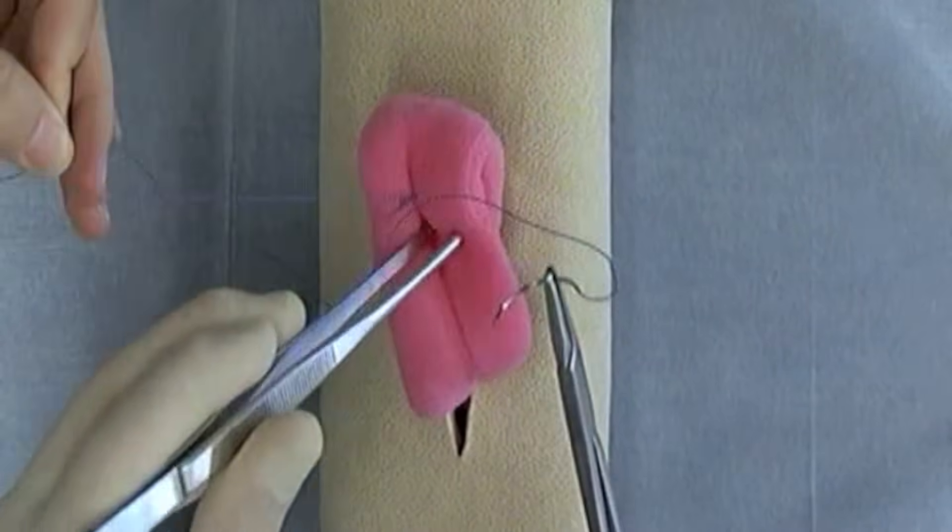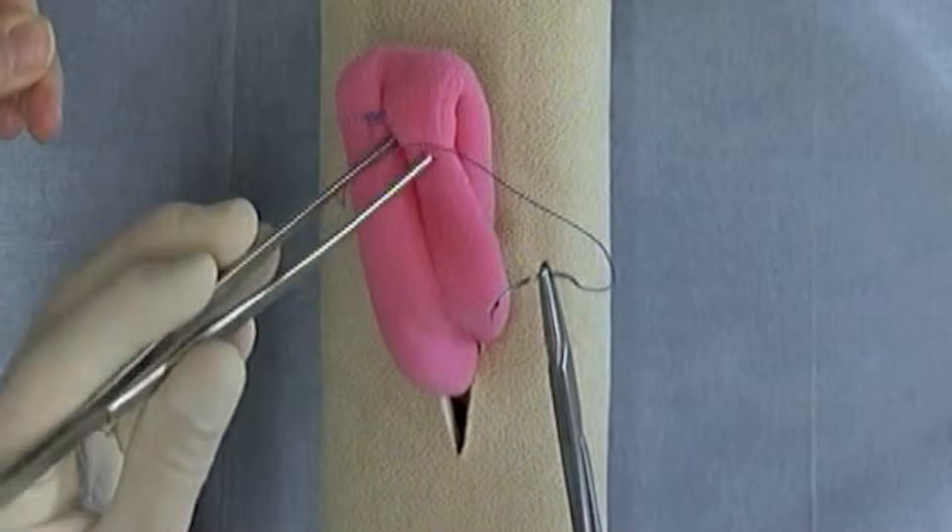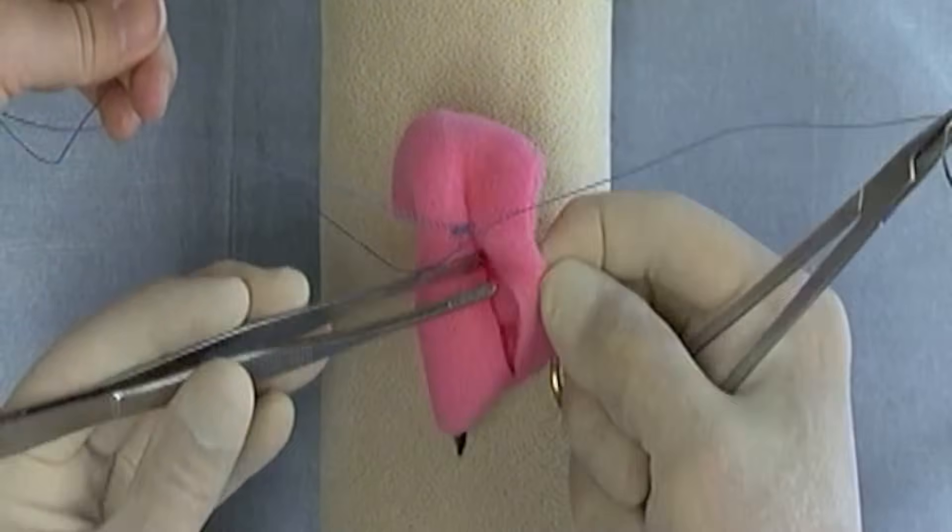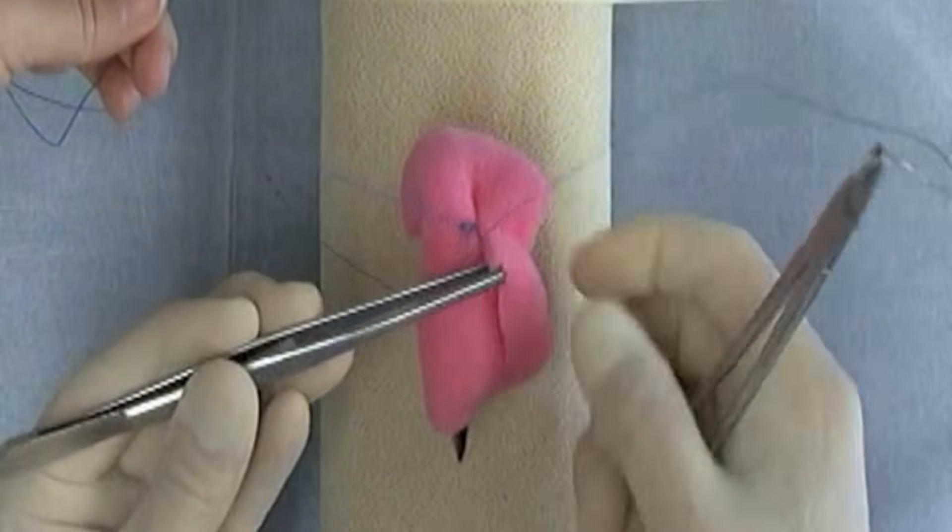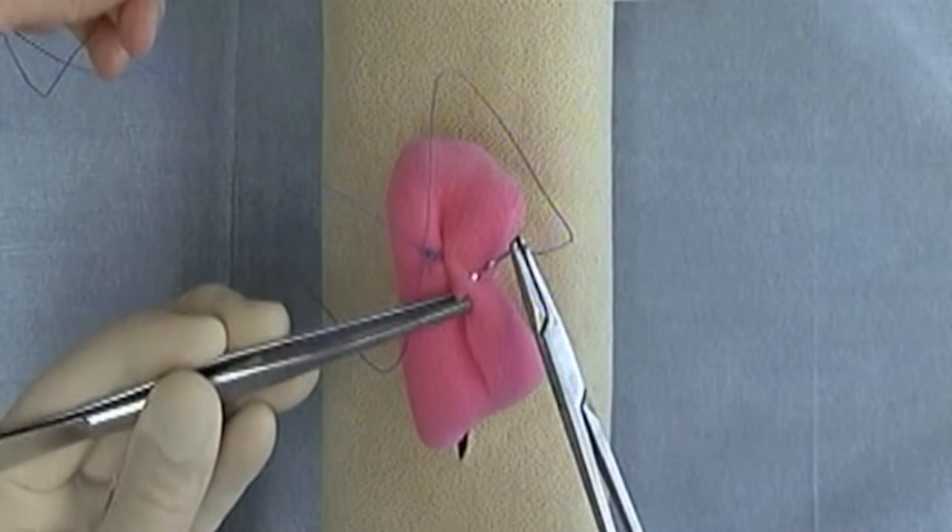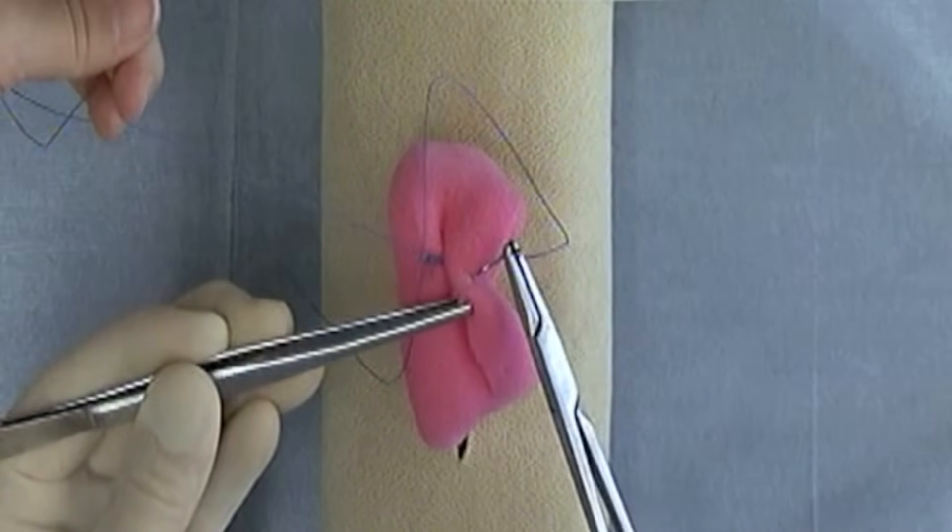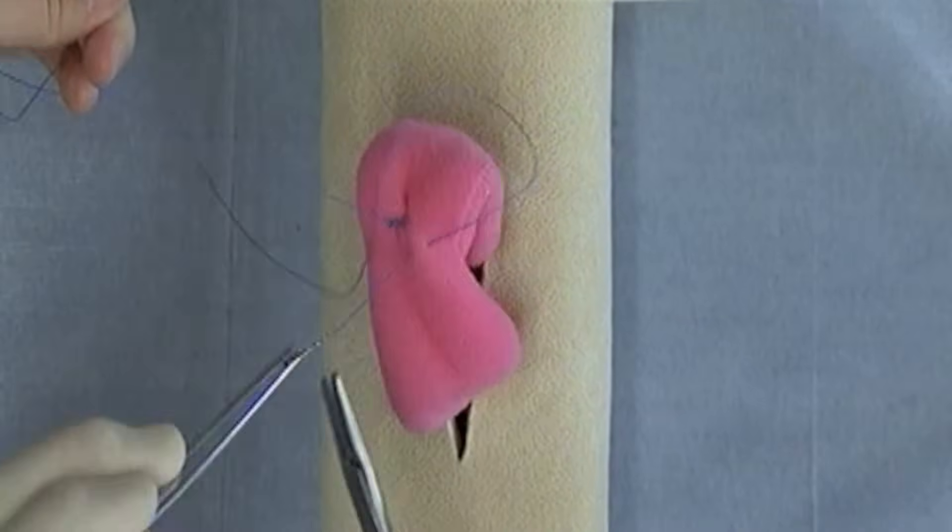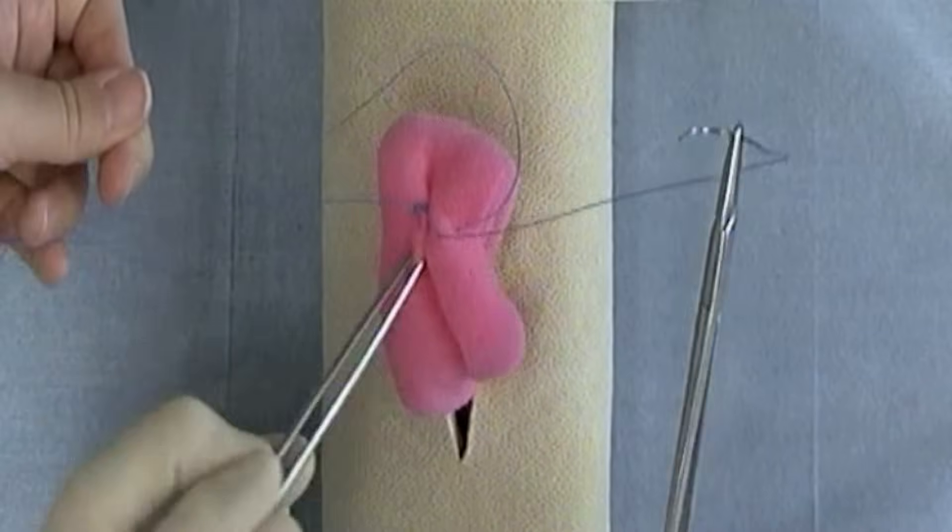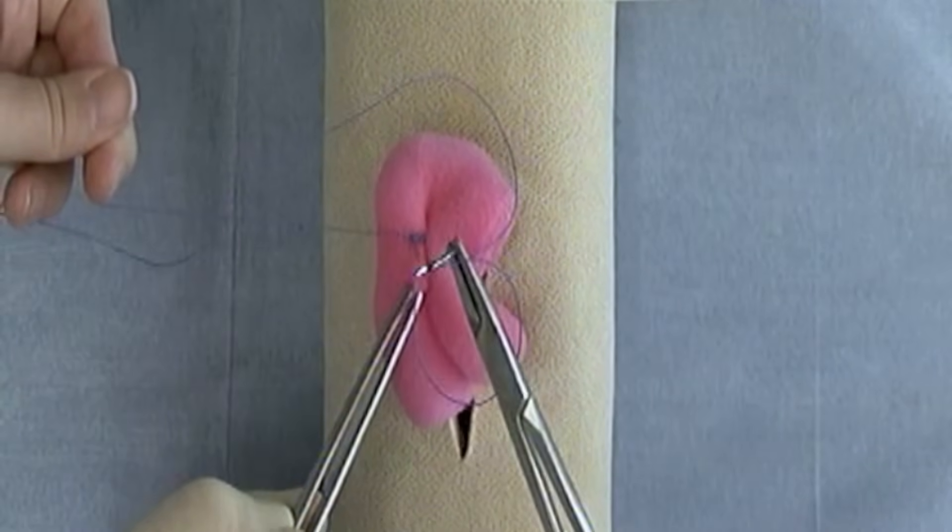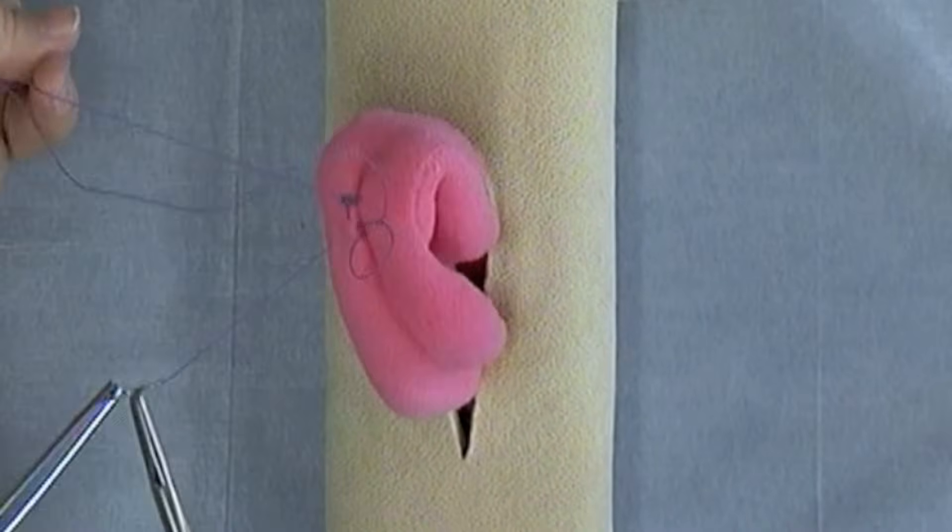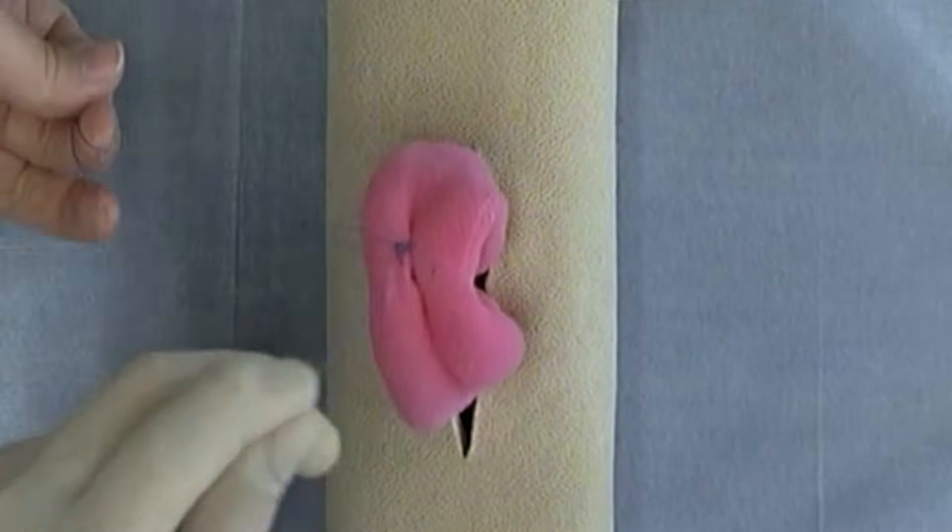So now simply I repeat the process for as long as I need to. I'm going to take a bite. You can see how inverted this is. I'm going to take a bite into the intestinal wall and out of the intestinal wall on the near side of the incision, and in a similar fashion go into the intestinal wall and out of the intestinal wall on the far side of the incision.